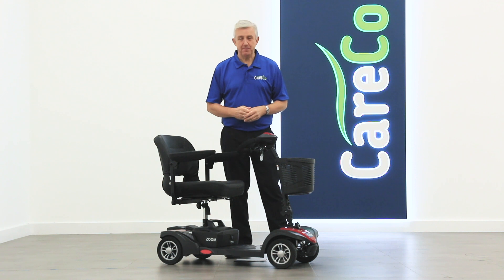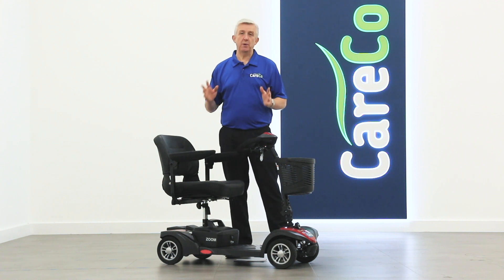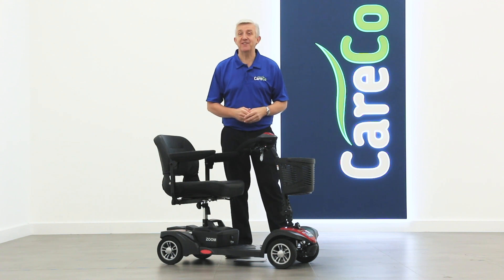With the right setup and basic maintenance, your travel scooter will boost your independence and quality of life for years to come. In this video we're going to show you some simple steps that you can take to get the very best out of your scooter.